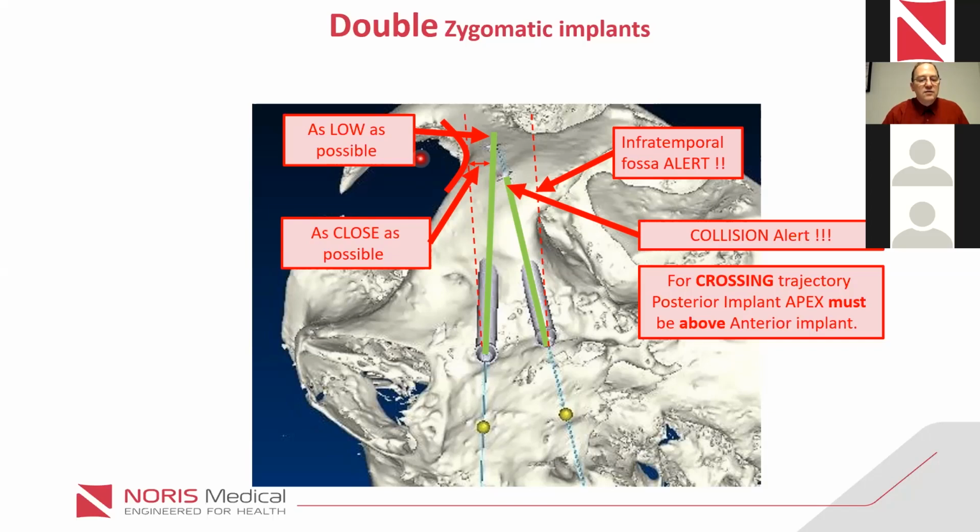Look where the orange is. It's a much shorter implant. Or look at the blue. It's a much longer implant. So this is very gentle. What you see here is like 2, 3, 4 degrees to each direction, and you need like plus minus 2.5 or 5 millimeter difference of length of implants.